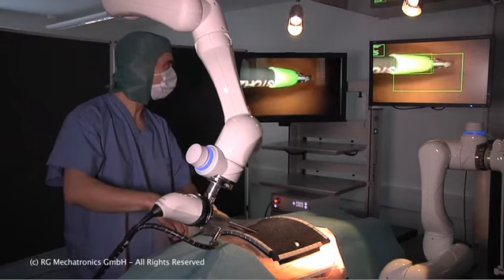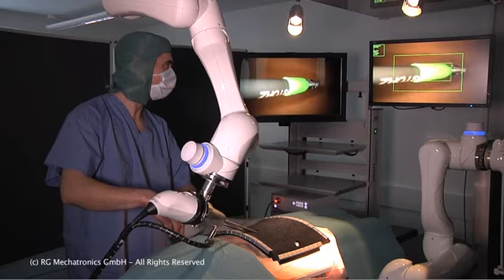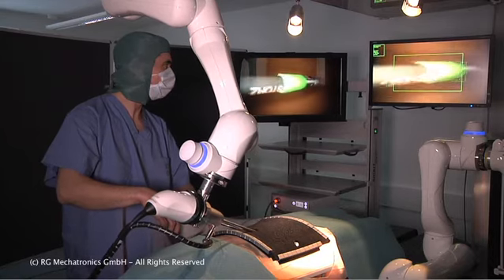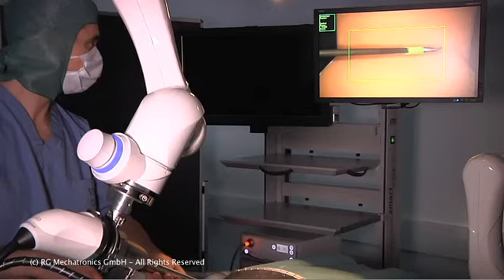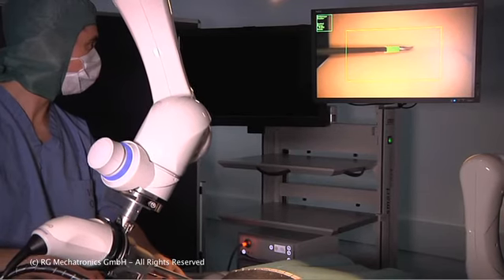When the rectangle identifying the tool moves out of the central rectangle, the endoscope driver is compensating for the motion and follows it. It also tries to keep the size of the tool constant within the picture, which leads to an automatic zooming function. At this point, you can see the motion of the robot as it moves in and out.